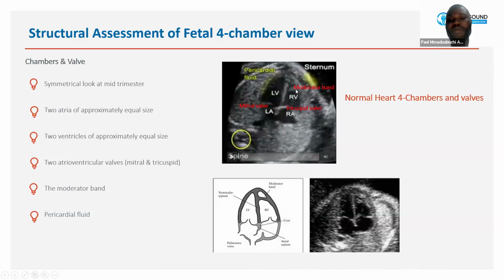As you can see, my arrow is located on your right ventricle. You can also see that the walls of the right ventricle are not smooth. It has trabeculated walls, while the left ventricle has a smooth wall and cone shape, and there is no moderator band in your left ventricle.